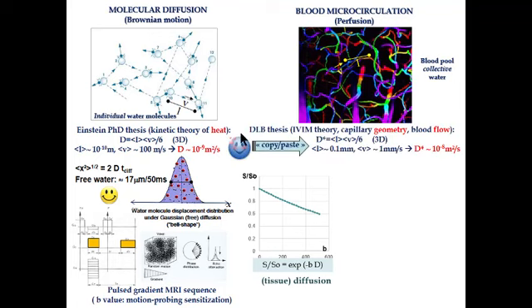When I wrote my thesis, I loved Einstein's work, so I decided to do a copy-paste, replacing L and V by those values. It has nothing to do with diffusion, but I use the same equation. Now the length is about 100 micrometers and the velocity is about 1 millimeter per second, so I get a pseudo-diffusion coefficient of 10^-8.